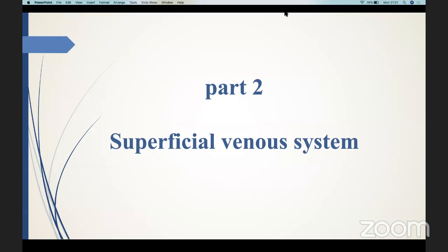Like I said, the acute is hypoechoic and the chronic is hyperechoic. Subacute DVT is when the ultrasound features are of neither acute DVT nor chronic post-thrombotic changes. So you can't apply the criteria of an acute to that particular finding, and you can't describe it as chronic, which is not quite bright, not hyperechoic and not hypoechoic, in between.